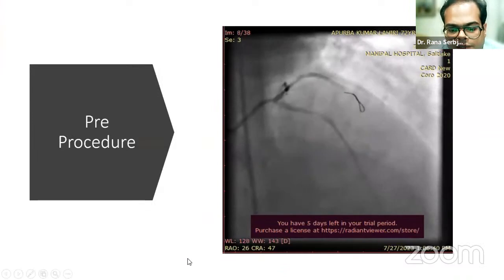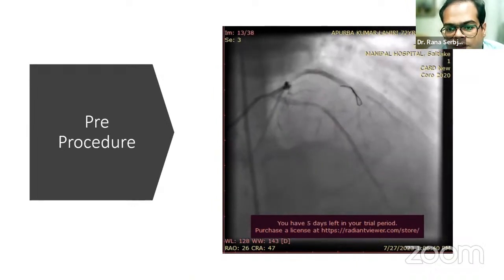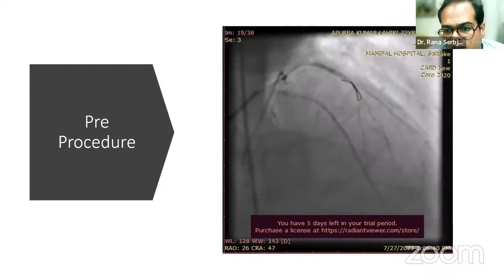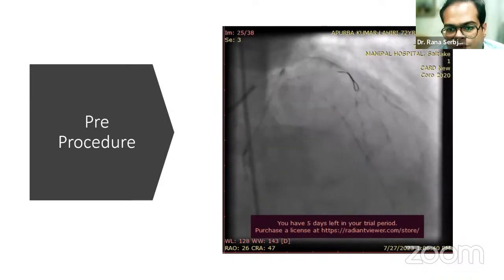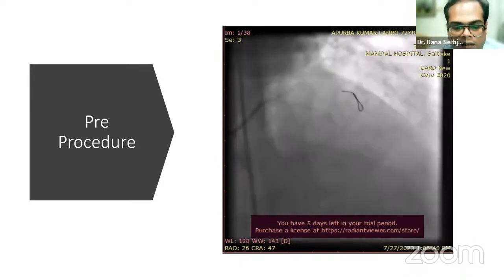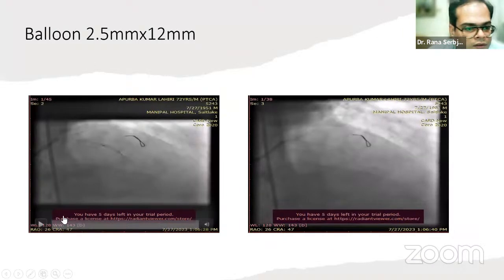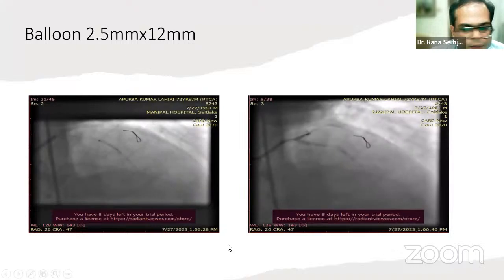Our initial strategy, after the angiography was done, was to put a stent in the proximal LAD, and then complete the LCx. Because in the angiographic views the ostia of the LCx was showing around 50 to 60% plaque, our plan was to finish the distal vessels first, and then go for a bifurcation stenting of the left main and the LCx. The next slide. So the LAD job was done, pre-dilatation, stent deployment. If you can see the videos here.